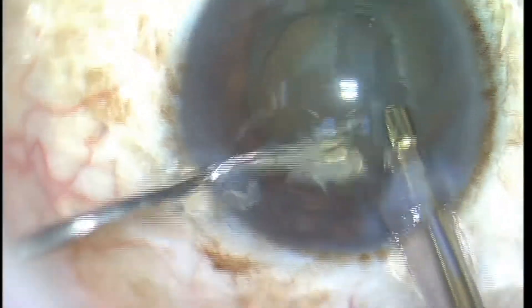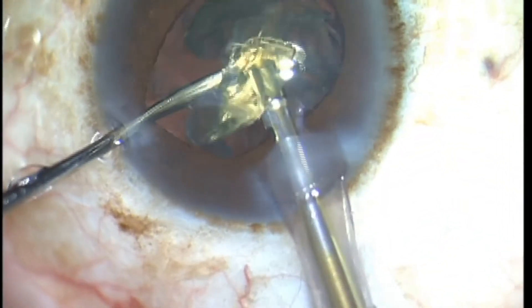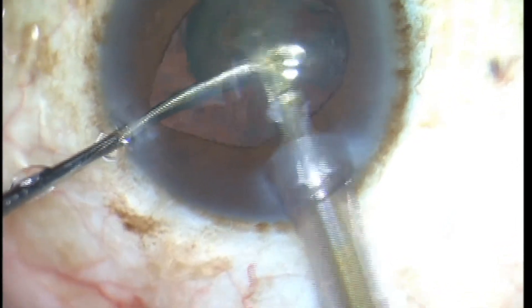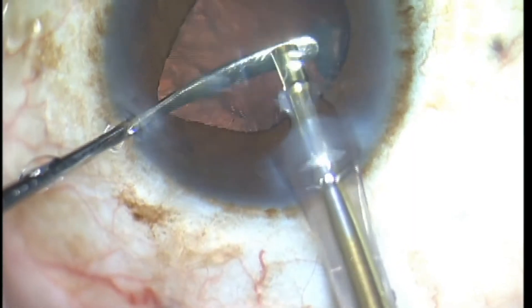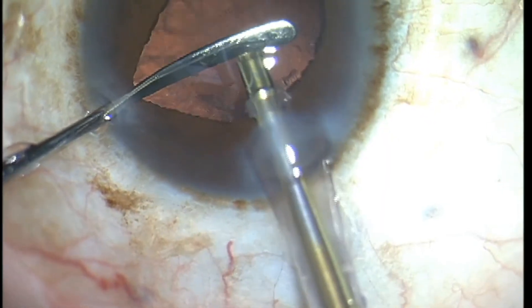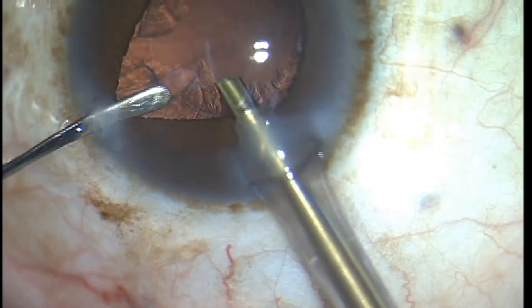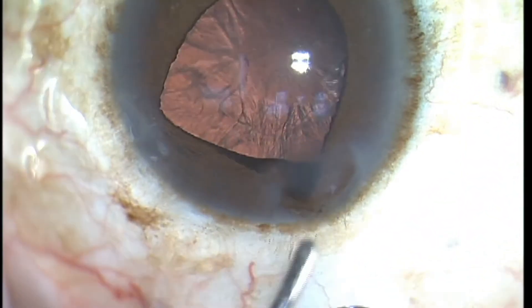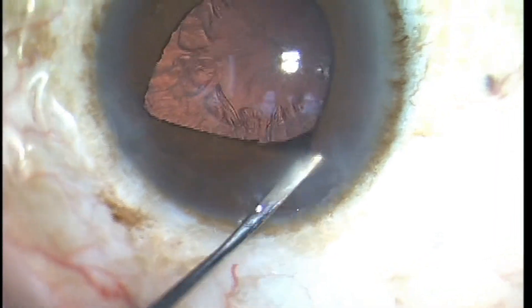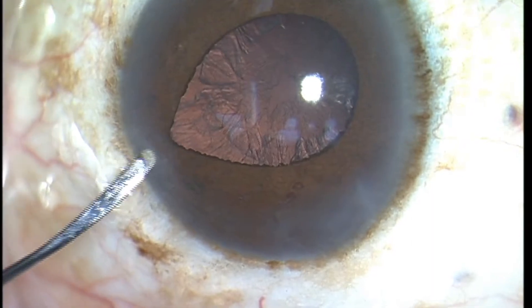We started out with a beautifully dilated pupil, and as I'm taking the last remnants of the nuclear fragments out, you can see that the pupil is no longer round. It's actually slightly peaked towards my side port incision. And now as I'm taking my phaco tip out, the iris is prolapsing through the wound. This patient has classic intraoperative floppy iris syndrome, IFIS for short.